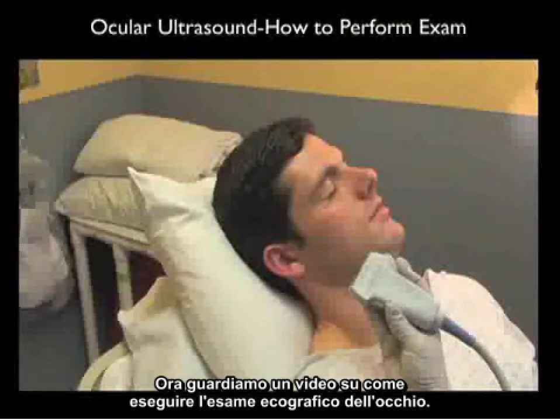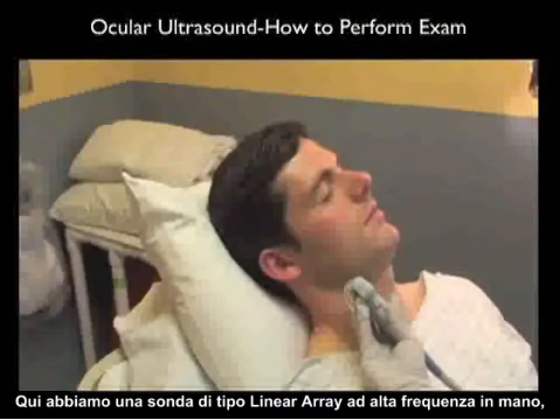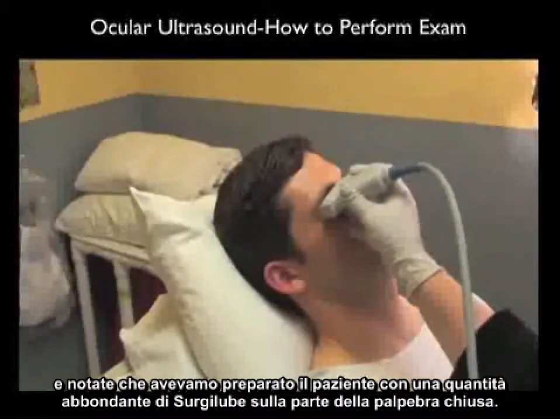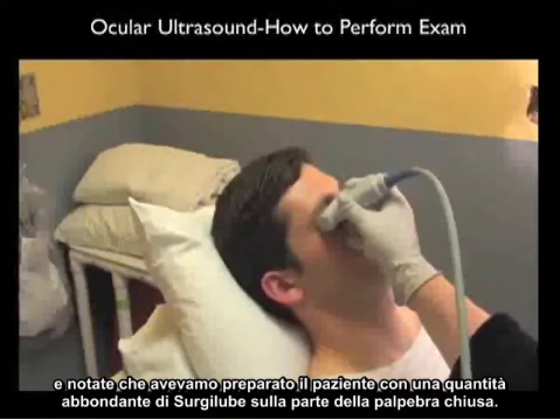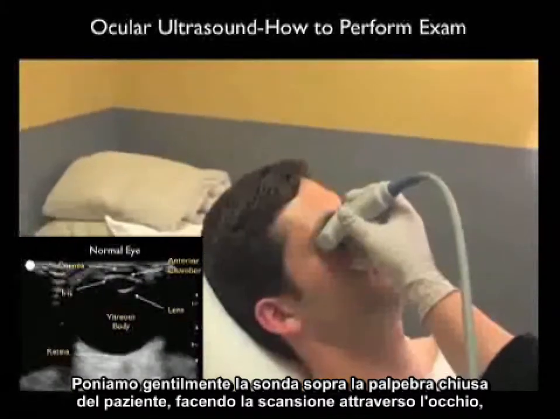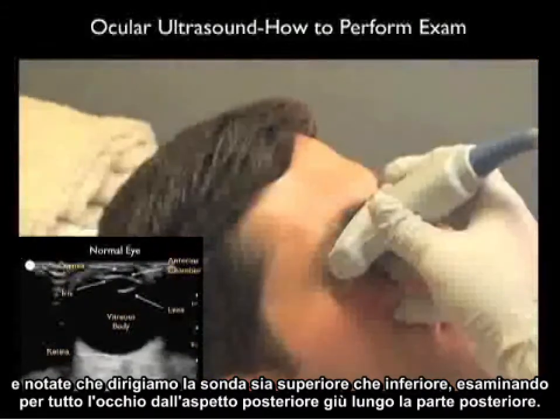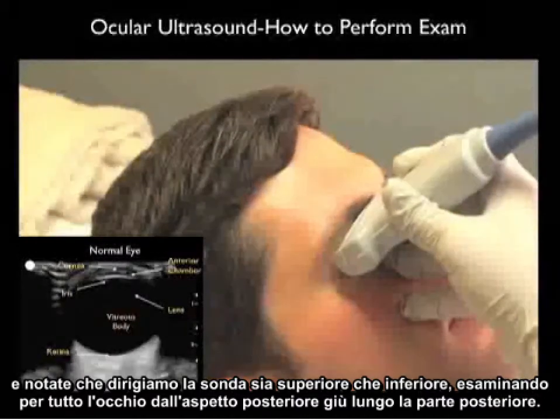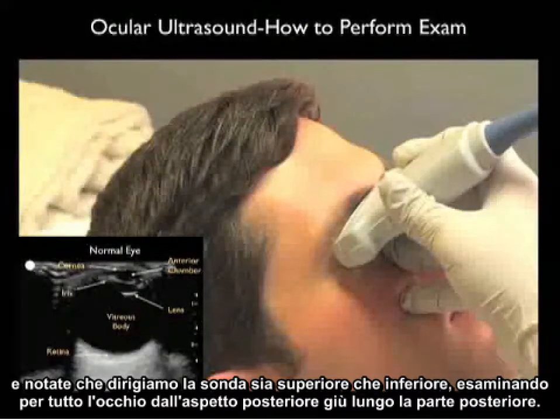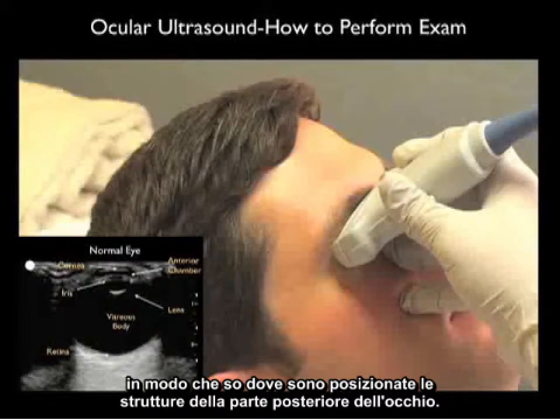Now let's watch a video on how to perform the ocular ultrasound examination. Here we have the high-frequency linear array probe in hand, and note we've prepared our patient with a copious amount of surgery lube on the outer part of the closed eyelid. We're going to gently place the probe over the patient's closed eyelid, scanning through the eye. Note that we're going to orient the probe both superior and inferior, looking all the way through the eye from the anterior aspect down through the posterior part. I like to have the probe marker oriented laterally towards the outer part of the patient's face so that I know where the structures of the posterior part of the eye are oriented.